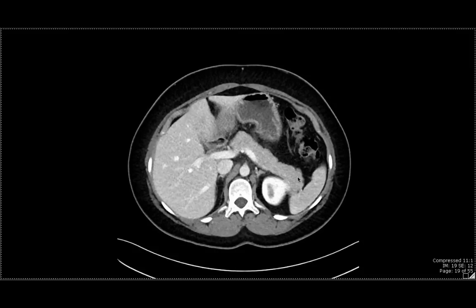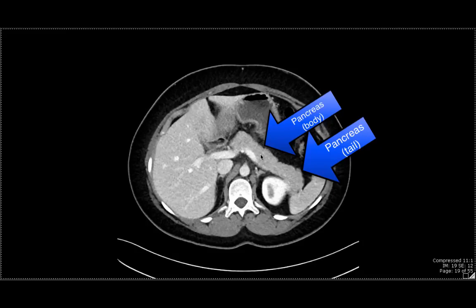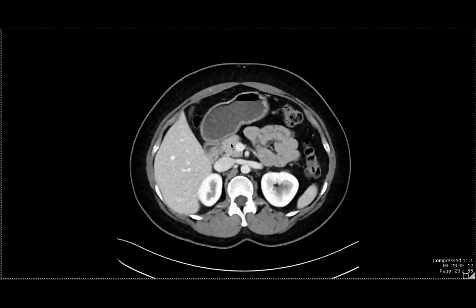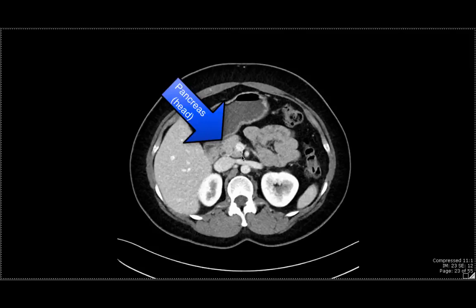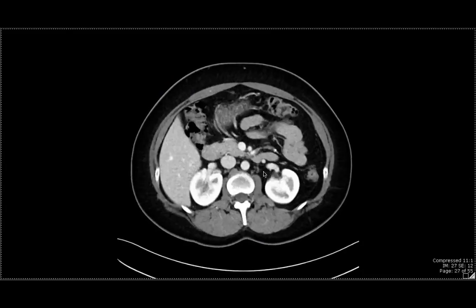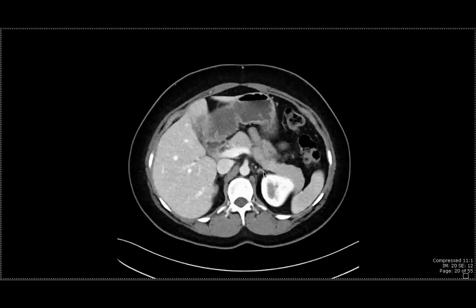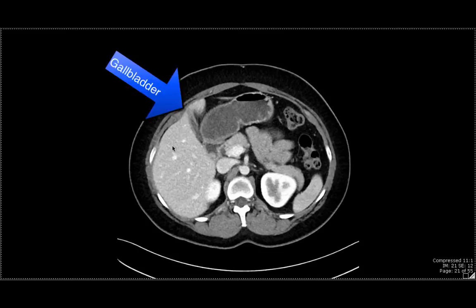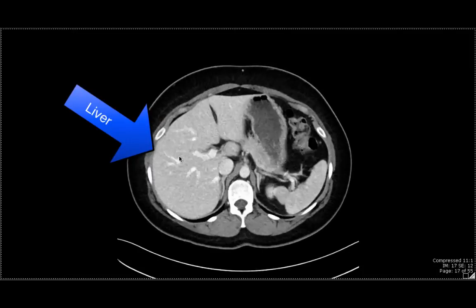We can also see the pancreas. This is the pancreatic tail as it abuts a portion of the spleen, the pancreatic body, and the pancreatic neck. As we go down, we can see the pancreatic head, and the sharp, almost triangular-shaped structure is the pancreatic uncinate process. On the right upper quadrant, we can see this oval-shaped structure — it's a little bit underdistended, but that's going to be the patient's gallbladder. Surrounding the gallbladder is the liver.